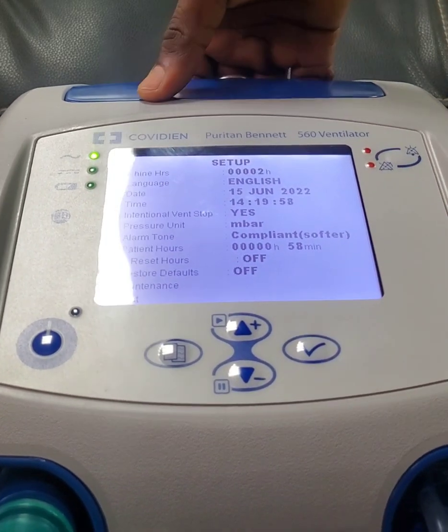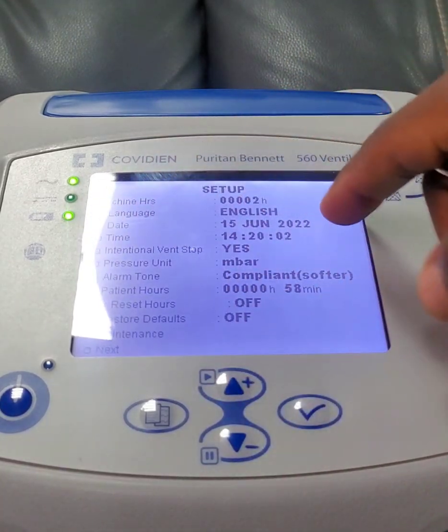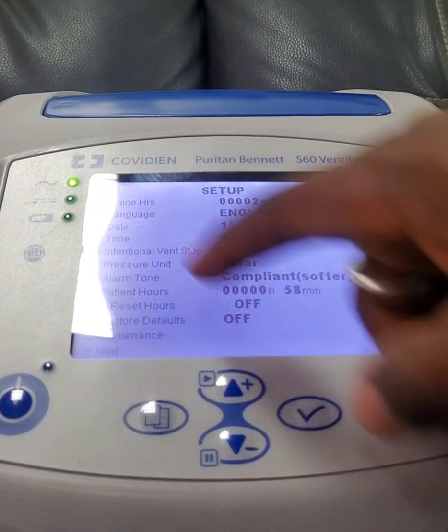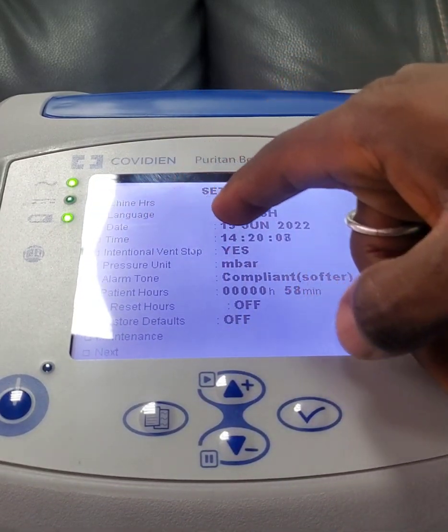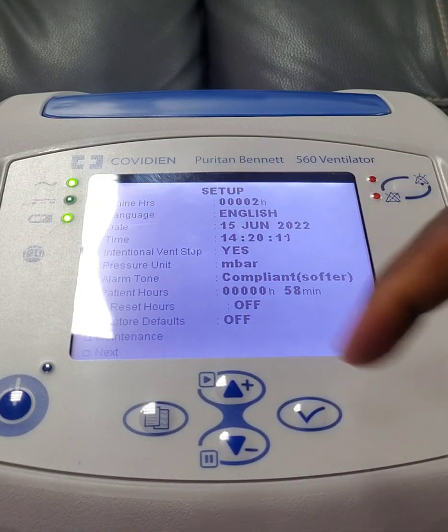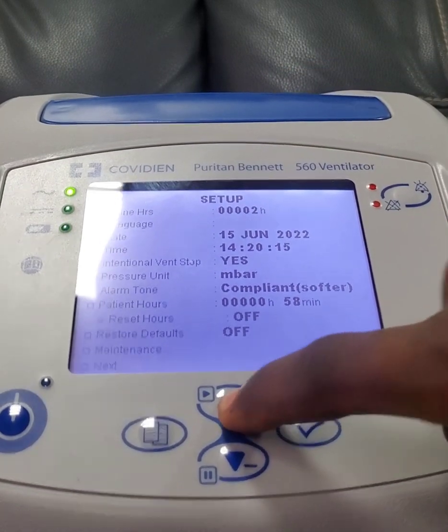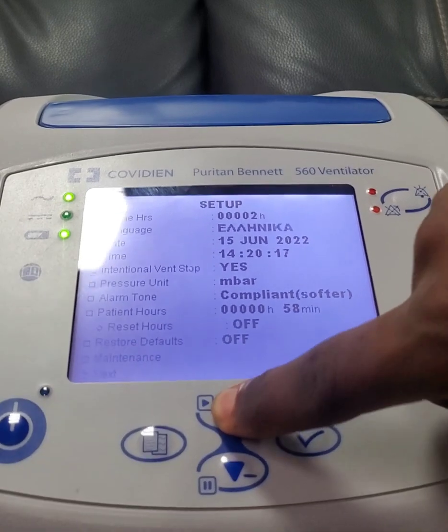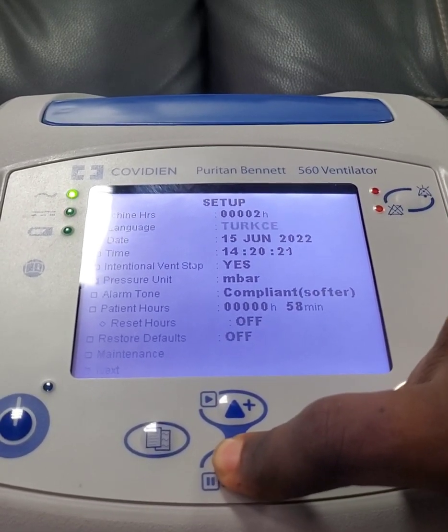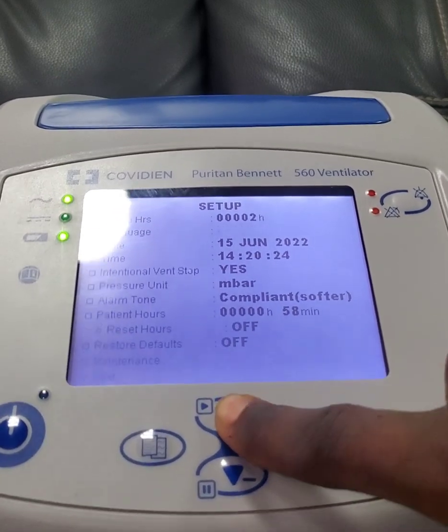Now it's in setup mode. This first option is the language. This machine is currently set to English. It was also showing the number of hours this machine has been used. Click on 'Yes' and you can change to a different language — Dutch, Chinese, Turkish. Let's leave it on English.